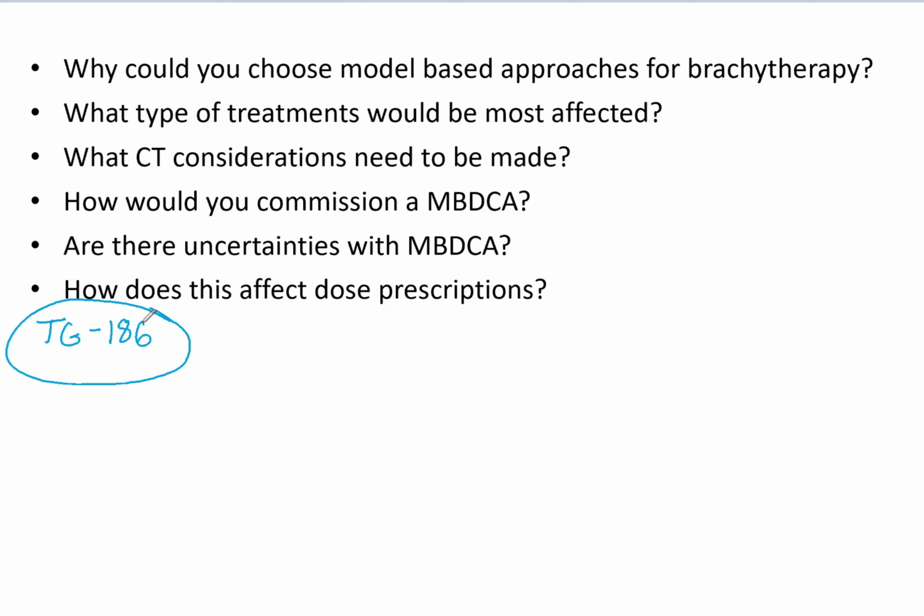That's what brachytherapy has always been based off of. So we know it works through clinical trials. But if we want an accurate depiction of the dose distribution that is actually being given, we need to account for that. Also, TG43 does not account for the interseed attenuation. It also doesn't account for the patient dimensional boundaries. So all those things wrap into potential reasons why you would want to consider a model-based approach that uses a heterogeneity correction.